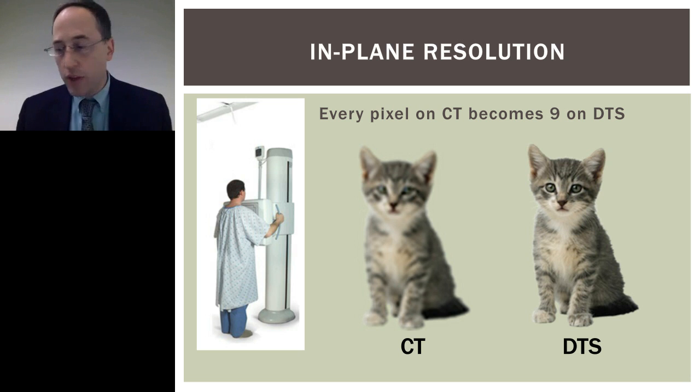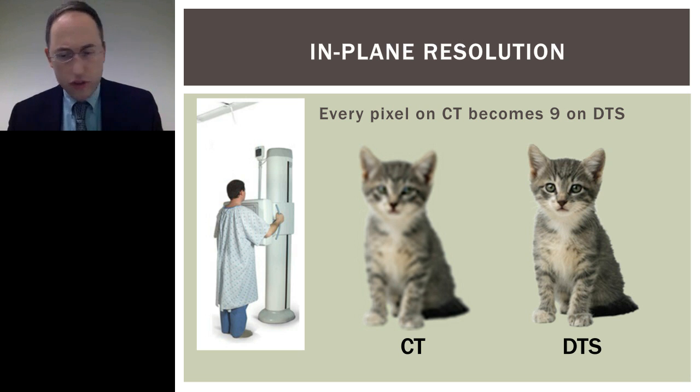And this really comes through when you look at cases of things like fibrosis or cystic fibrosis. You're looking for reticulation and things like that. They're very, very crisp on tomosynthesis, whereas on CT, you just end up with this ground glassy look because you're actually losing that resolution.